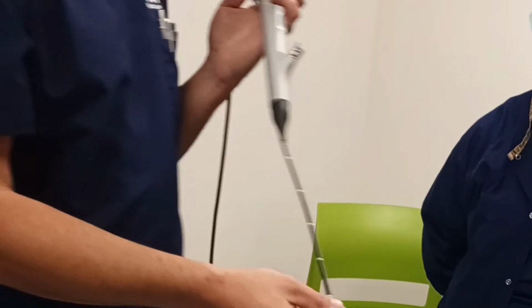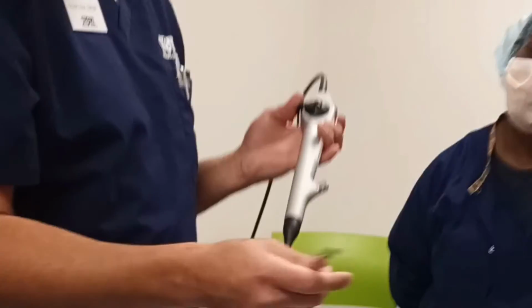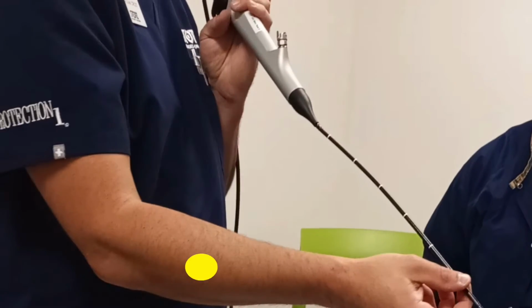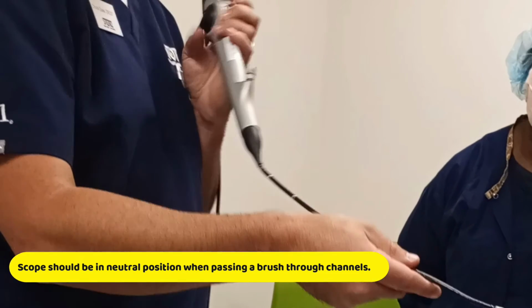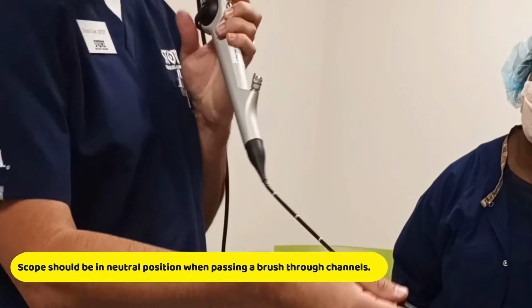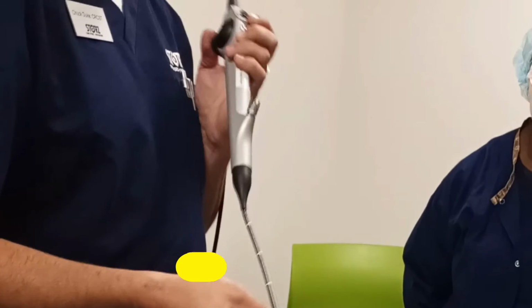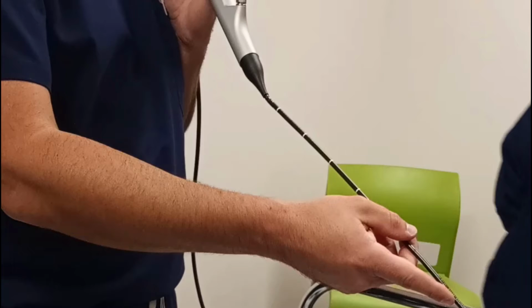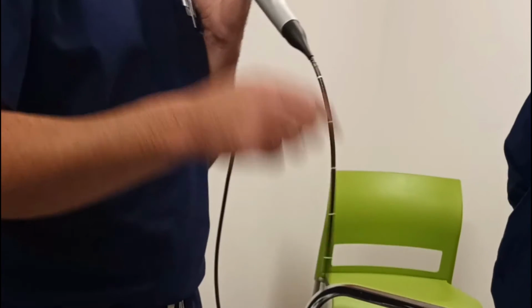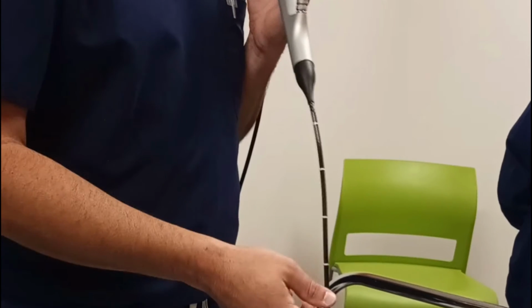When you're sticking the brush through the scope, be very mindful of this as well. You want to make sure the shaft of the scope, the distal tip, is in a neutral position. If you have it to the left or to the right and you're sticking that brush through it, it might puncture the inside of the scope, and now you've damaged it as well. So make sure the distal tip is in a neutral formation. That way the brush rolls through the scope smoothly and isn't hitting up against the wall.